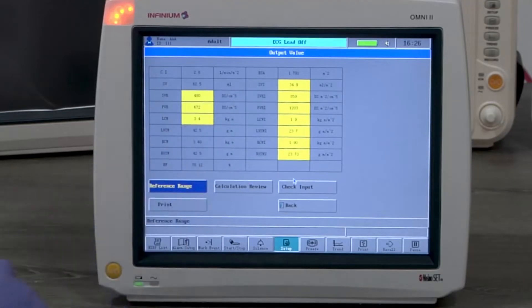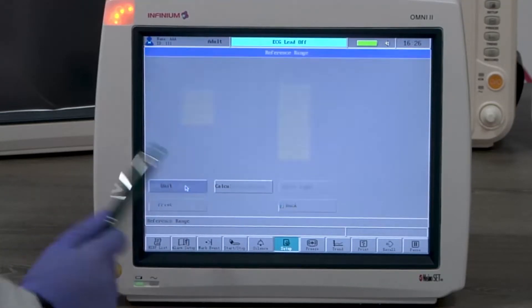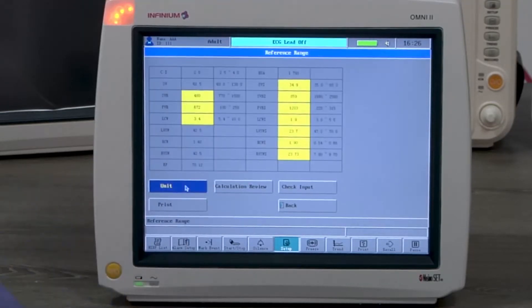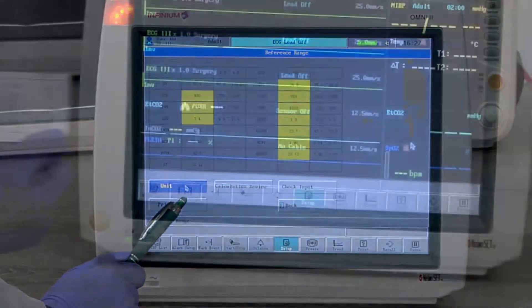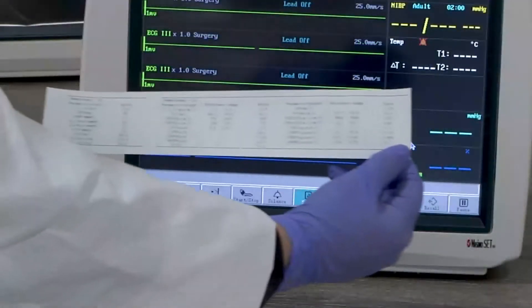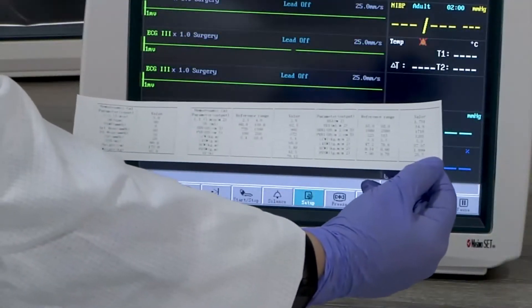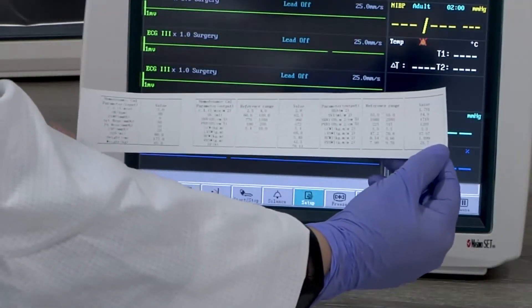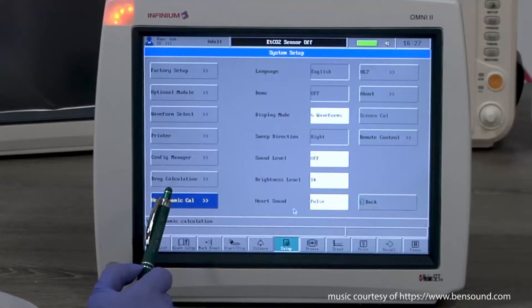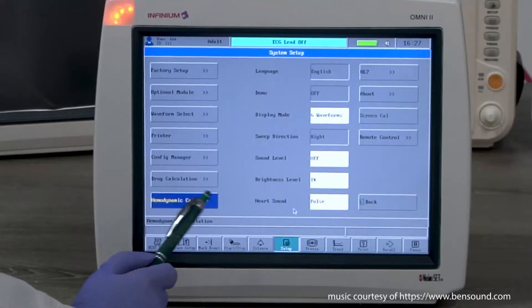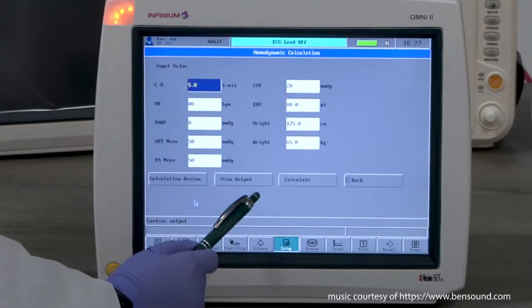The numbers marked with yellow are the ones out of reference range. You can select the reference range to see the range. Select print to print this table for the record. Here is a sample printout of the readings and their reference range.